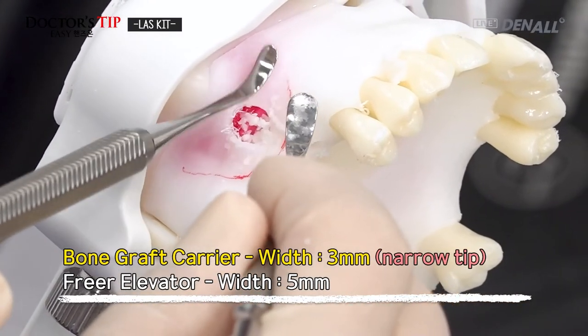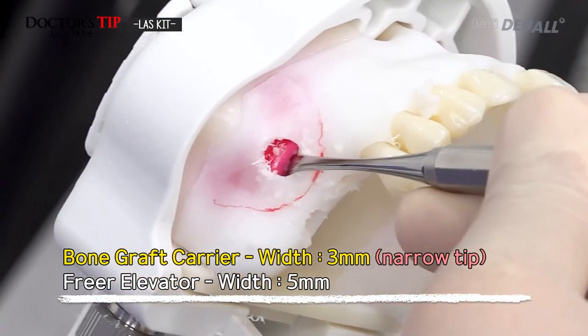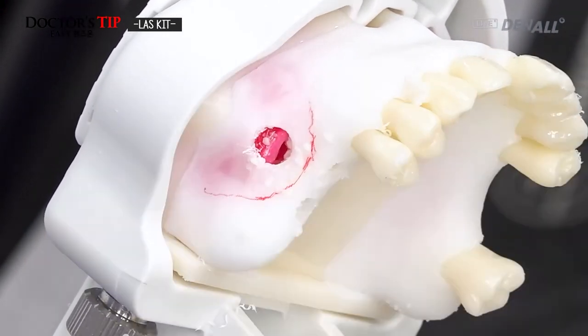And if you think the window is too small or narrow, then again, the free elevator's diameter width is 5 millimeters, and this one, the bone carrier, is narrower, 3 millimeters. So even at a narrow site, bone grafting can be performed very well.